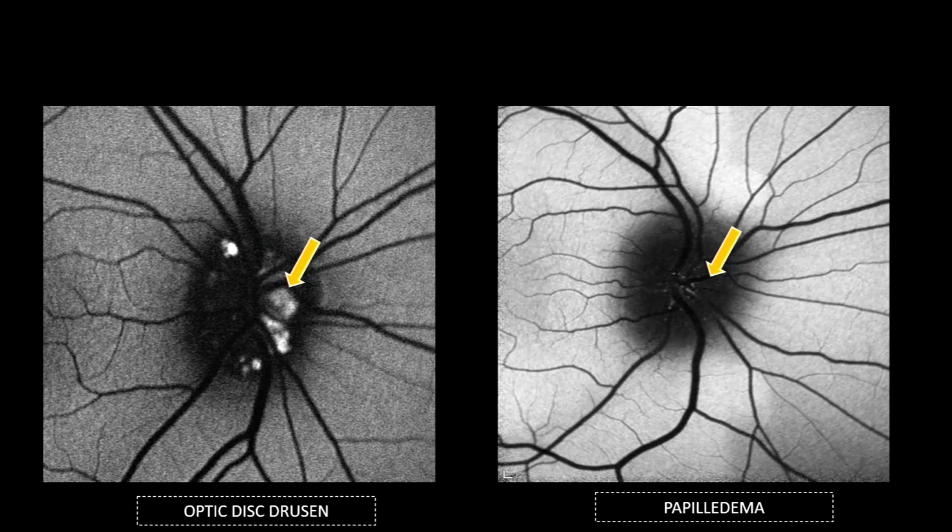Just for information, this is how papilloedema or disc edema looks in the autofluorescent imaging system.